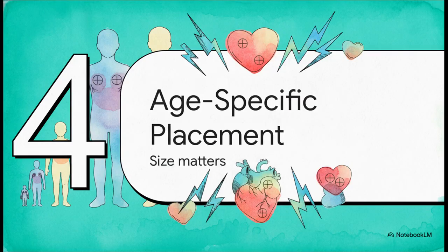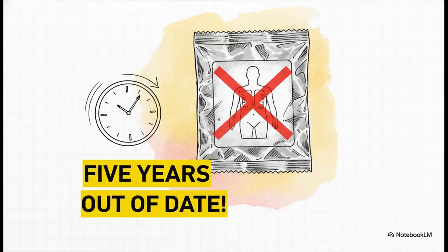Let's head to Section 4, pad placement by age, because size really does matter here. Pad placement is immensely important for both rhythm analysis and shock delivery, and it varies significantly depending on how old and how big the patient is. Okay, listen up, because here is a crucial warning.